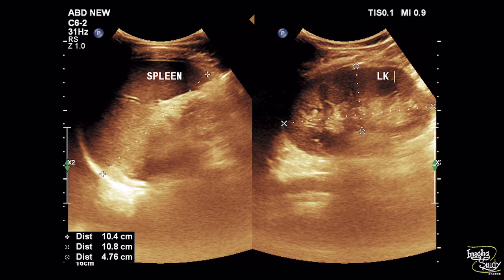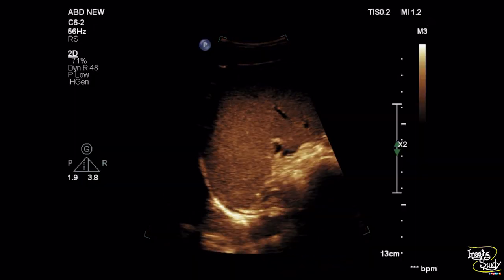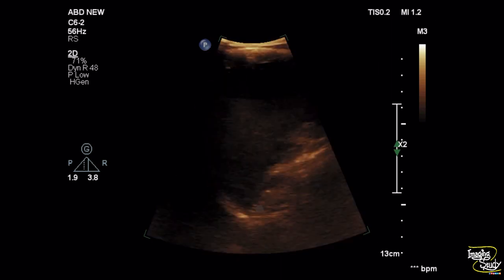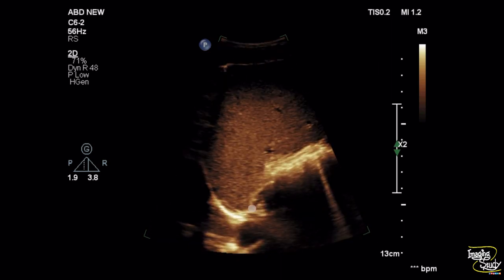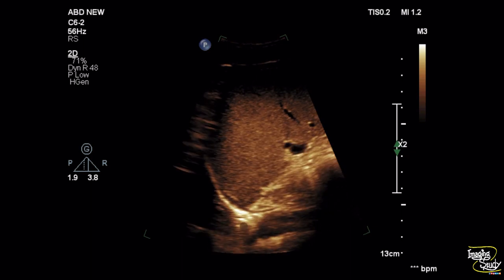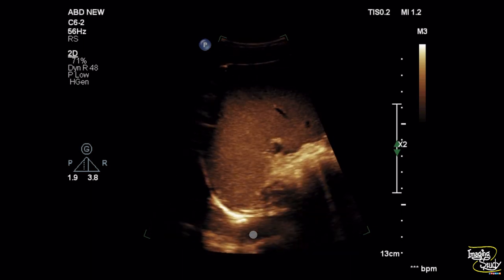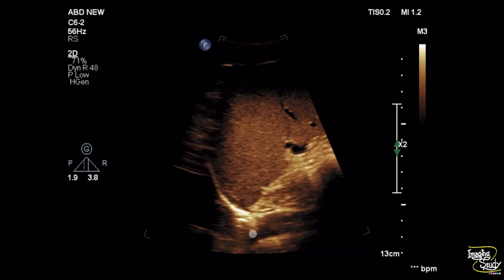If you look at the left kidney it looks normal in size but the echogenicity is quite increased if you compare it with the adjacent spleen. If you look carefully at the upper pole of the spleen, you may see a small amount of collection noted at the left pleural cavity, indicating left-sided pleural effusion.